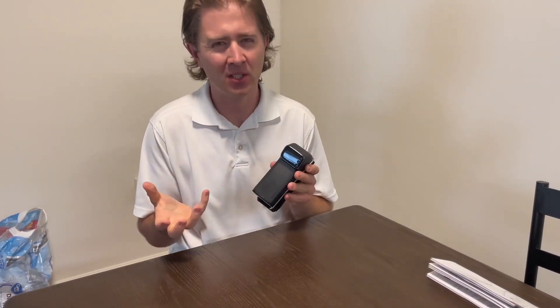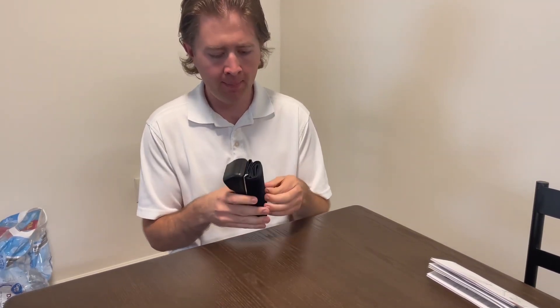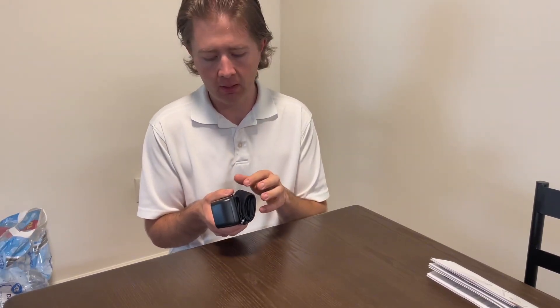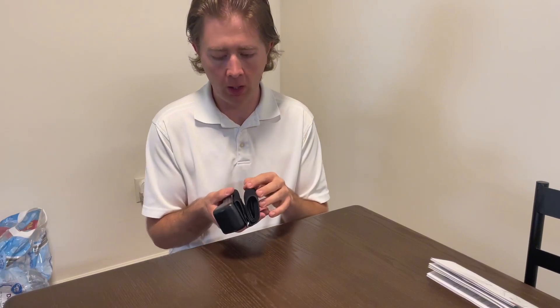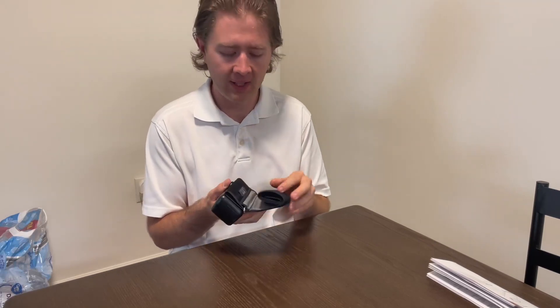Hey, this is just a quick video of the specifications of the product. The main one I wanted to touch base on — because you are not able to take this cuff off — I just want to make note that you will need to make sure that your arm is the correct size.